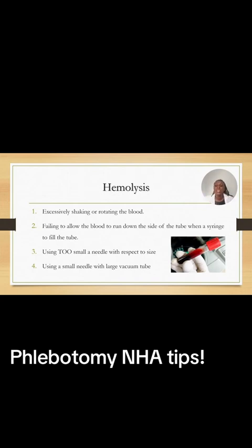I want you guys to remember, when you're taking the exam, it's: how do I solve the problem? And if I can't solve the problem, how do I protect my patient? Okay? And how do I protect myself? Remember the three things that I just said. How do you protect yourself? How do you protect the patient and the integrity of the specimen? Or what can I do to fix the problem? So with hemolysis, we know what the topic is. We know what causes hemolysis.